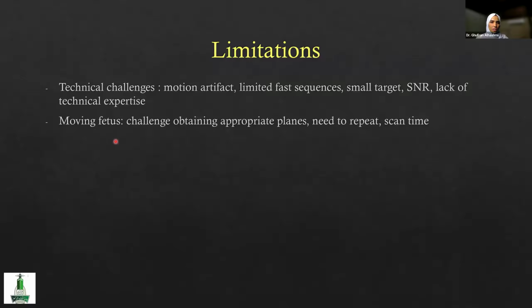The moving fetus also adds to the challenge, because sometimes you do the sequence and then you find that the baby moved and the plane is not as what you wanted, so you have to repeat the sequence. So that can add to the scanning time. It's also limited by maternal discomfort and anxiety.